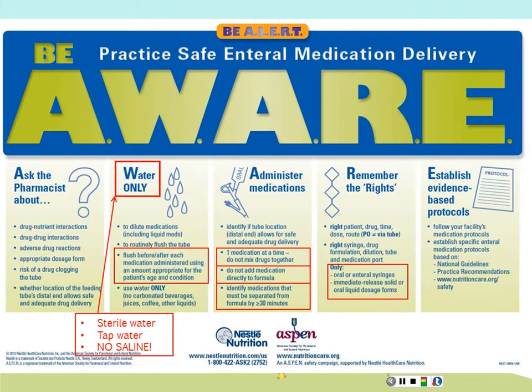You always want to flush these with water only, depending on the facility and agency policy. A lot of the times it is going to be sterile water. However, at home and with home use and families and things like that, sometimes tap water is used, and sometimes they may let them use that in the hospital. But you always want to know your agency policy, and water only, no saline.